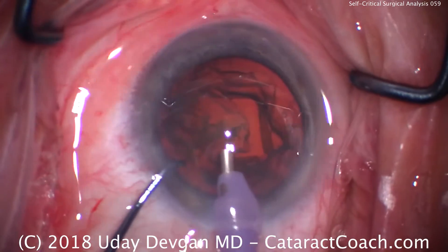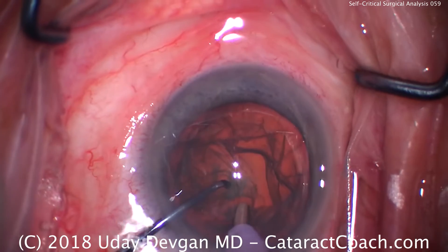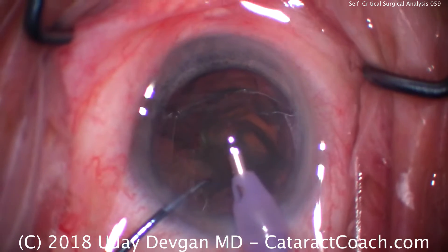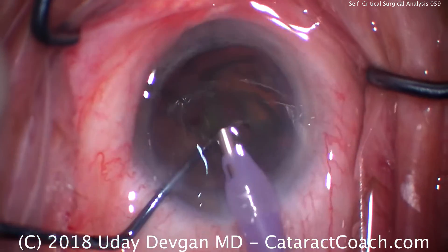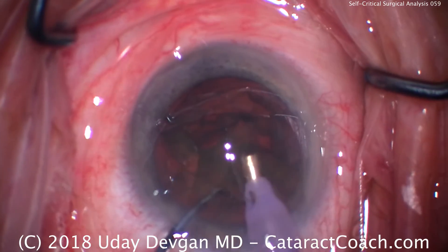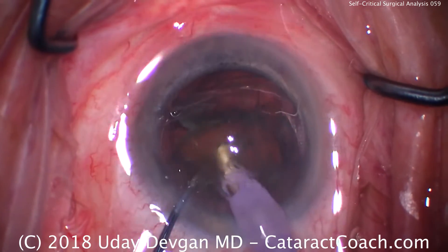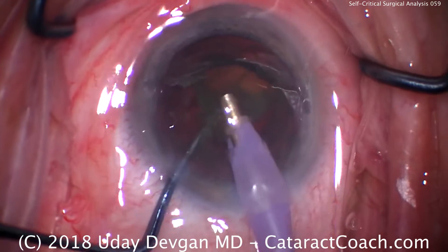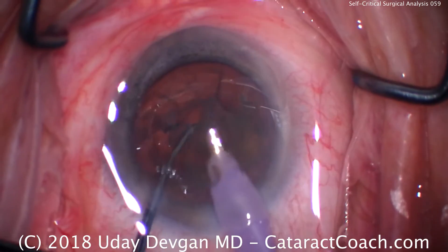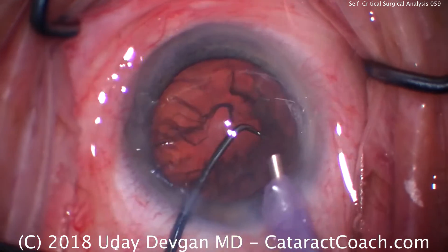We've got our instruments in the eye. We're going to buzz in the probe, advance the chopper — there's a chop in half and we'll bring the pieces up. I'm a little uncomfortable the way we're sitting; the eye's a little bit towards the nasal canthus. There's some conjunctival chemosis here. We're still proceeding with the case. There's the second half of the nucleus — we're getting that up. You can see that chemosis coming on now.